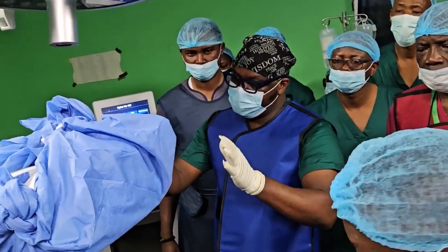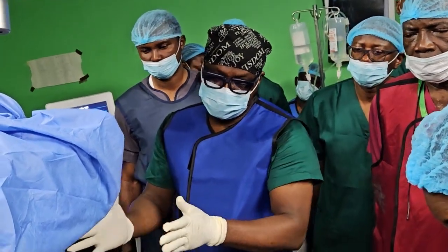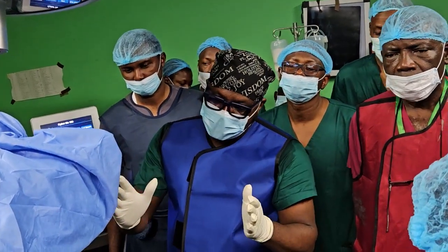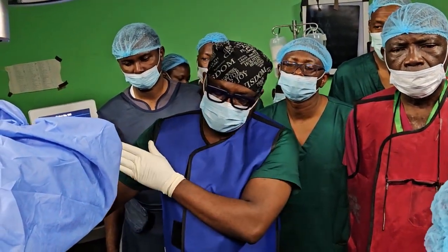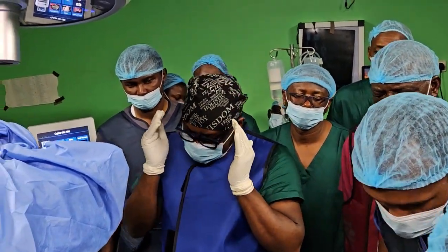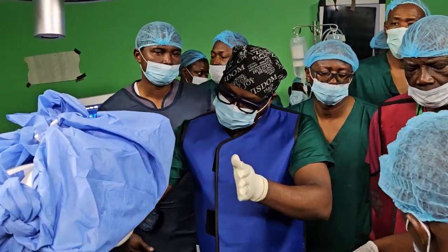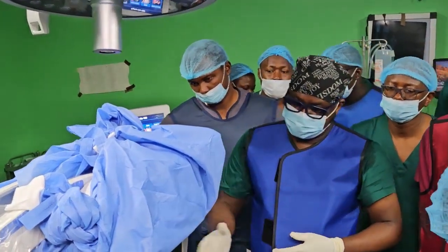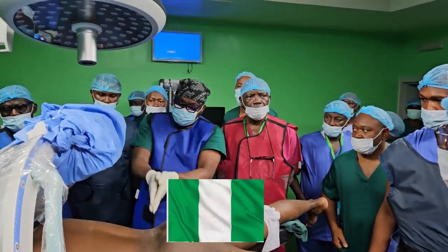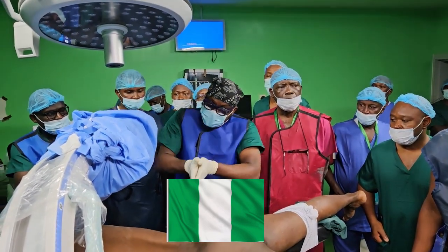So now, rainbow, listen. I've seen this has limitations. So what I want to do is either 20 degrees towards the end of the patient, because it's when you have two views that you can get your depth. You can't get depth if you can't have two views. So try 20 degrees or 30 degrees towards the end of the patient. I need this to know whether my depth is accurate. If it's not accurate, you come back to 0 and try again.